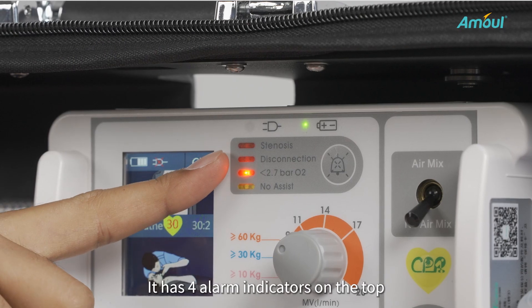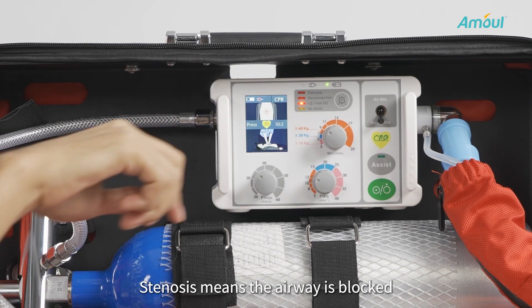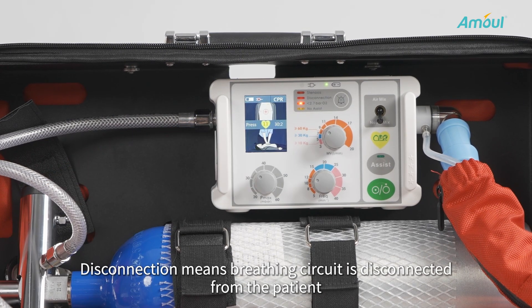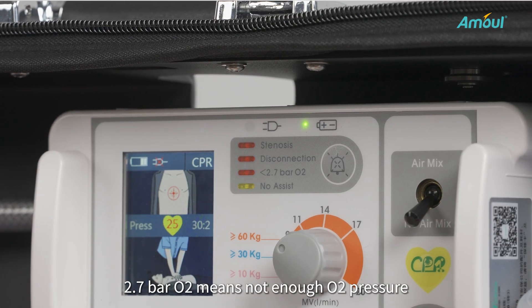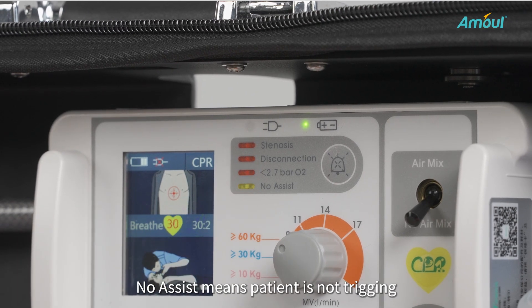It has four alarm indicators on the top. Stenosis means the airway is blocked. Disconnection means the breathing circuit is disconnected from the patient. 2.7 bar O2 means there is not enough O2 pressure. No ASSIST means the patient is not triggering.